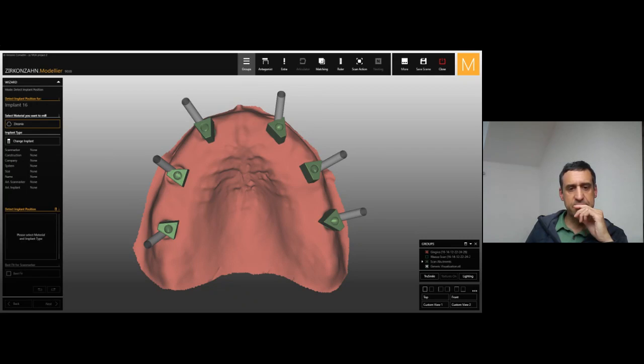And you can see from this slide the inclination of the channel screw coming out straight from the implant connection, and the position of the multi-unit, 17 degree angulated.